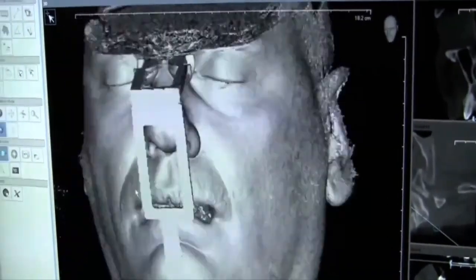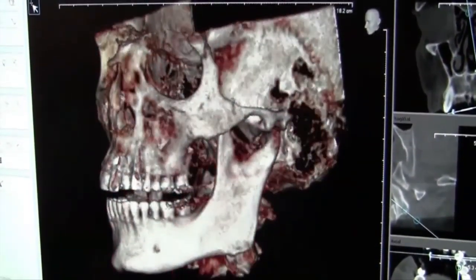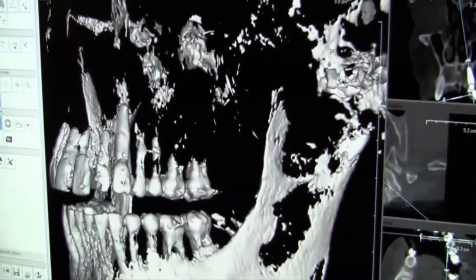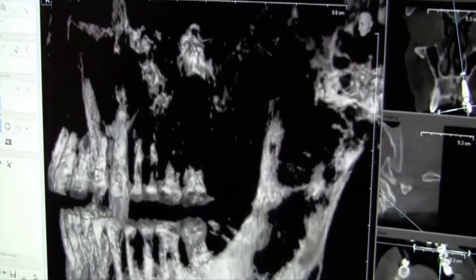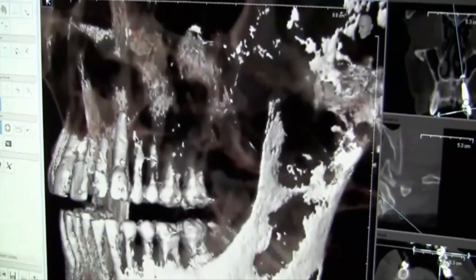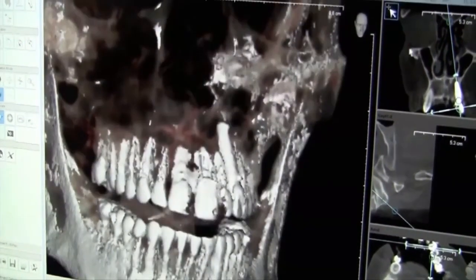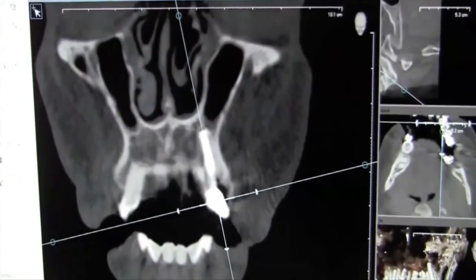So this is a post-surgical scan, and what we can see here is that we were able to maintain that facial table. We were able to get excellent placement, excellent position, excellent parallelism, good anchorage on a canine, which is a tooth that is undergoing a lot of function, on a patient with TMJ disorders and parafunctional habits. So in this type of patient, you need to try to maximize anchorage.